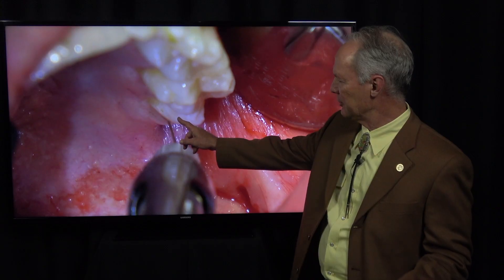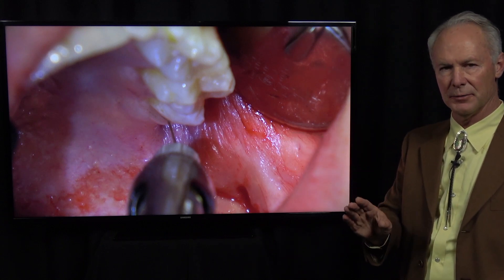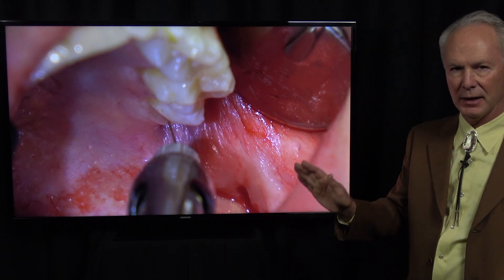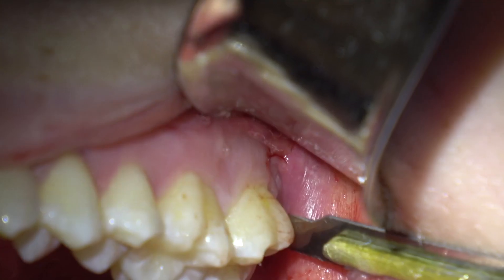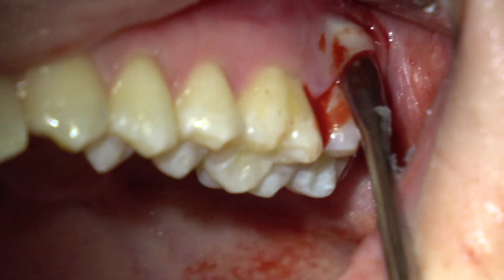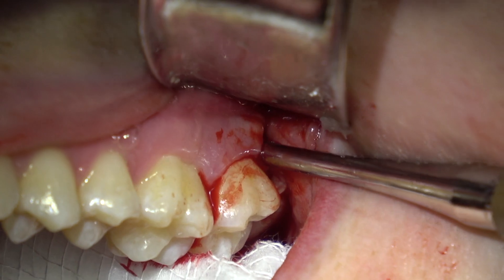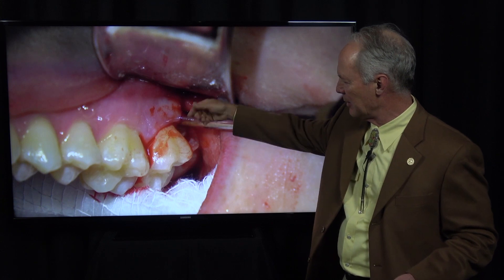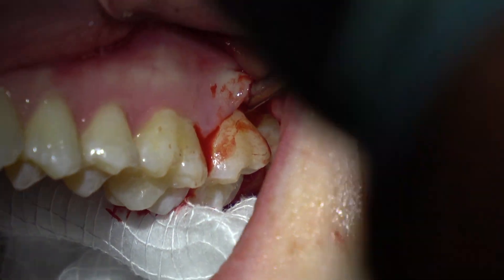This is very important — I'm giving an intraligamental injection before I extract the maxillary wisdom tooth. Always give the intraligamental and that tooth will be dead numb. The patient won't feel anything. Here's the wisdom tooth — I'm going to put an elevator right there and elevate it out. So a vertical incision off the distal buccal of the second molar, and then I'm reflecting all the way to bone. I'll place the periosteal elevator in that little space between the wisdom tooth and the second molar and elevate that, then come back with an E301 elevator. And there it comes — those are easy extractions.